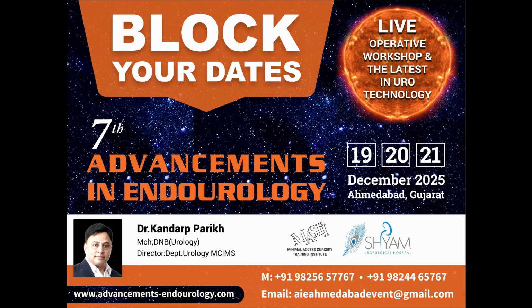Eric, by chance, during your extraperitoneal space creation or during your surgery, if there is an opening up of the peritoneum, that will be quite a detrimental thing to proceed. How do you manage at that time?